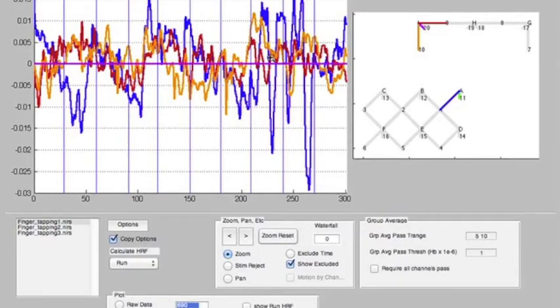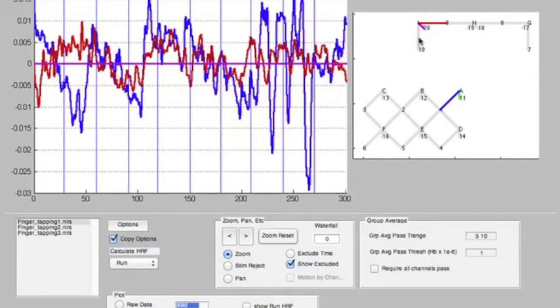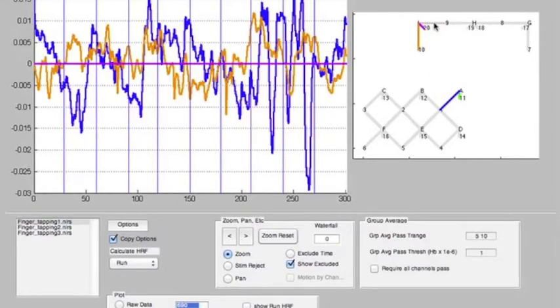As you click more and more channels, this display will get a little bit crowded. You can right-click on different channels. When you right-click the channel, it disappears and is hidden from the display. If you right-click it again, it's re-displayed.